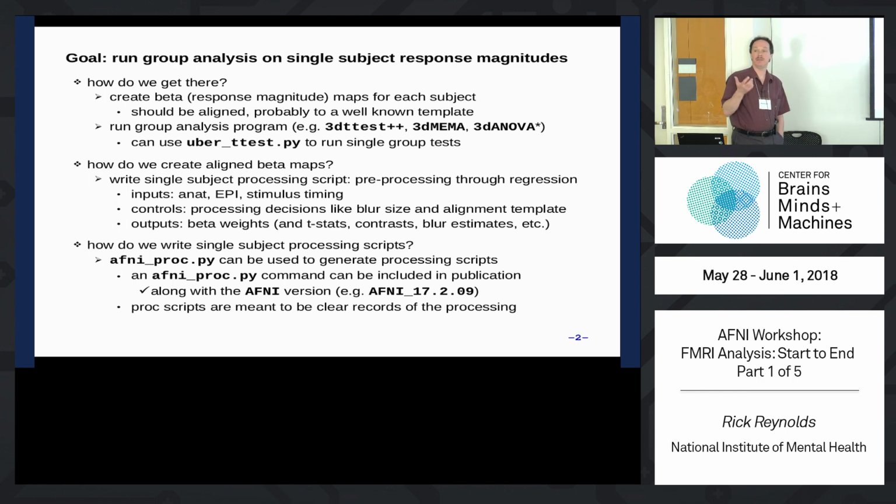If you start with some data, and even if you've got scripts written by some monk trapped in a wine cask for 100 years, don't just accept these as gold and go with them. Try to think about all the choices that are being applied in the processing and whether they're really appropriate, or at least understand them. Even if you accept them, try to understand them.